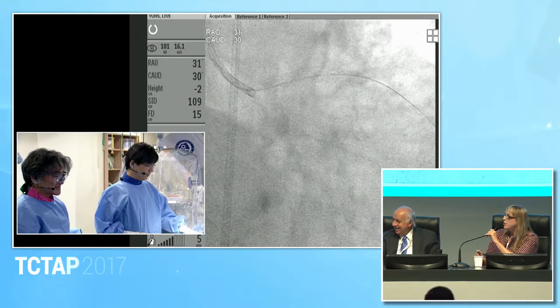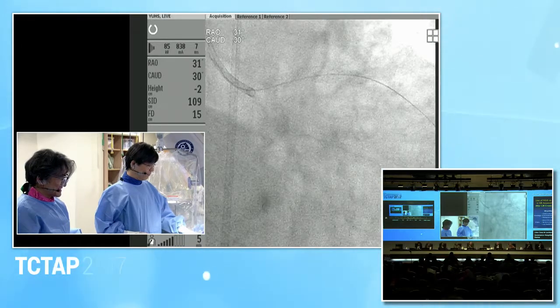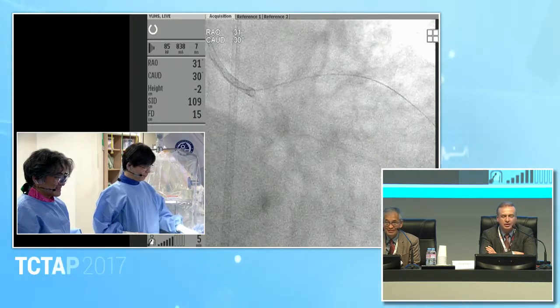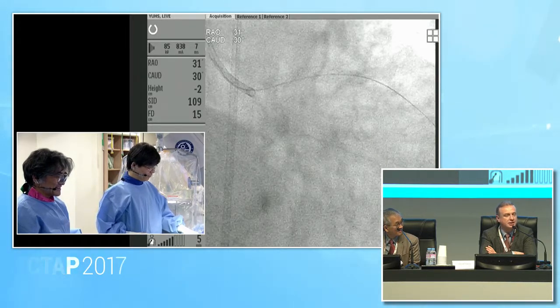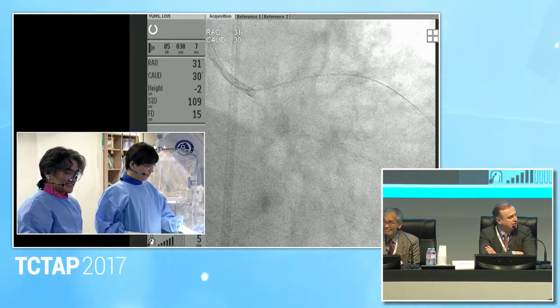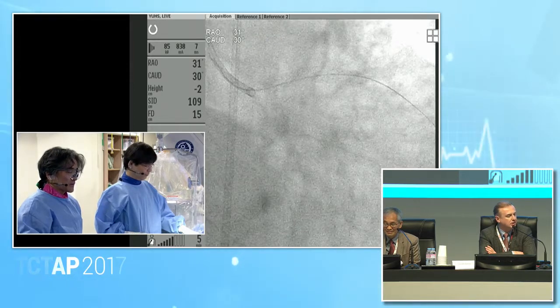Actually, what is the information? You can't see what there could be, a lot of many things. First of all, there could be complications. We don't know exactly. It could be in the distal part, everywhere. There could also be a wire perforation.